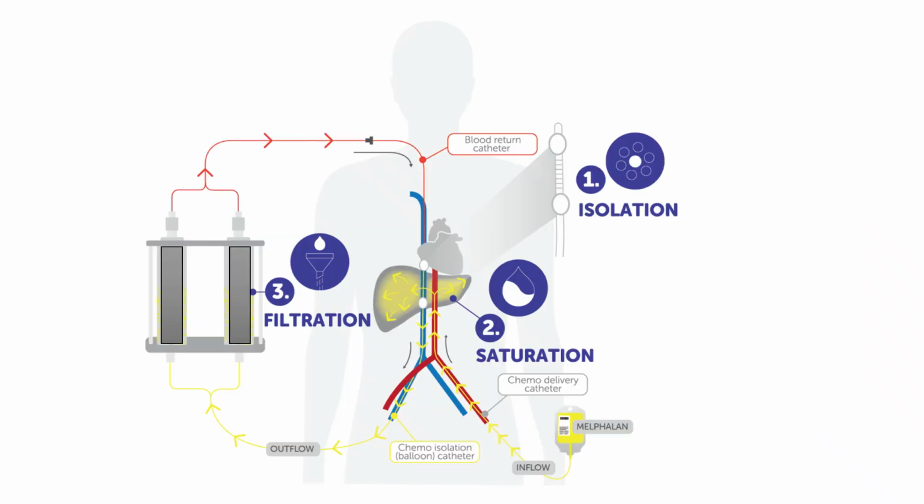This procedure is performed by an interventional radiologist and under general anesthesia. First, a left-sided triple lumen catheter will be placed in the IJ. That will be available for the anesthesia provider for any kind of infusion or any kind of transfusion that might be needed. Then the interventional radiologist will place a right IJ catheter, and that's for the inflow from the bypass line.